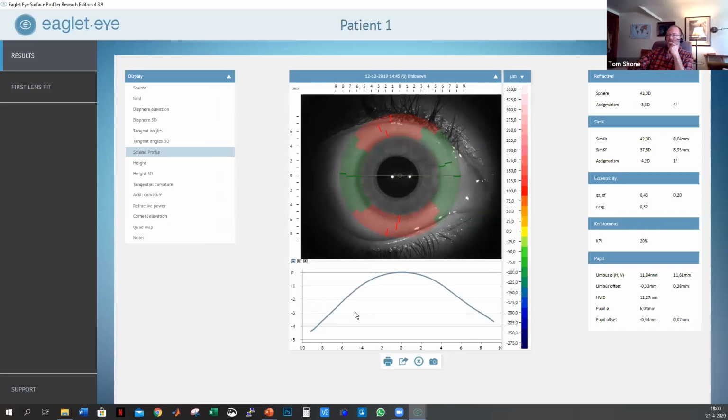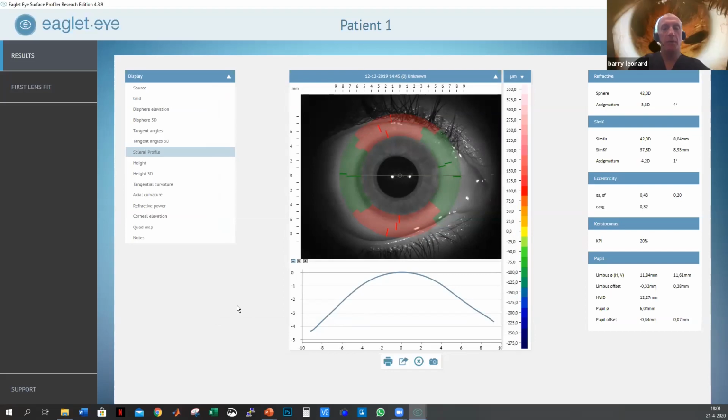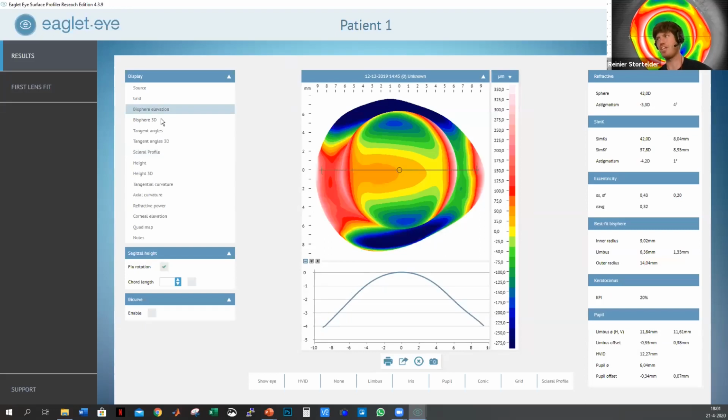Any other questions? So when I look at this image, you don't necessarily have to hold the eyelids open, it's on an as needed basis, right? No, you need to hold the eyelids open. Yes, you do. This is definitely not the best image ever taken.